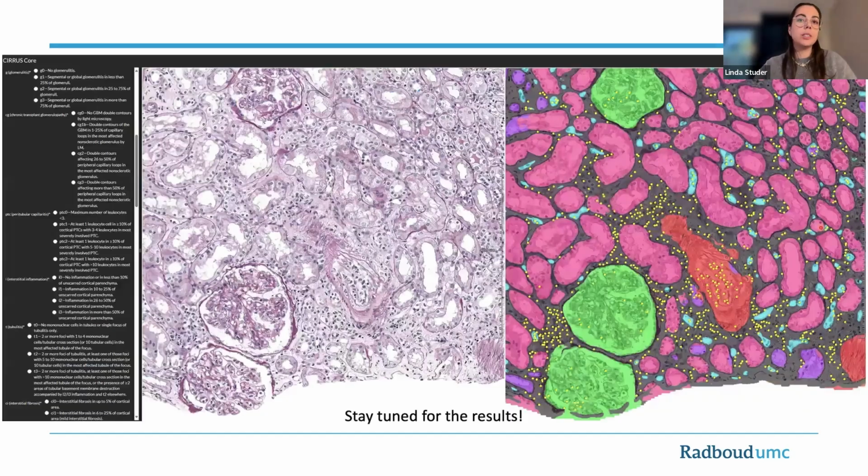And to give you an idea what this looks like, we're running this on Grand Challenge. It's quite small to read, but they have all the different Banff scores that they can go through as multiple choice. Here's the scroll bar, so it's a whole range of questions. In the end, they have some free-form questions about how they use the AI, whether they liked the outputs, and any feedback they would like to give us. And then they have the normal PAS stain that they can look at.